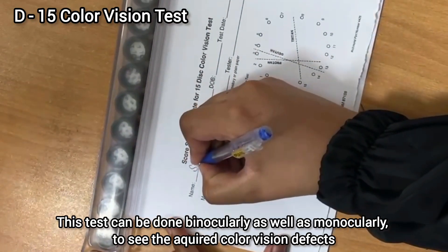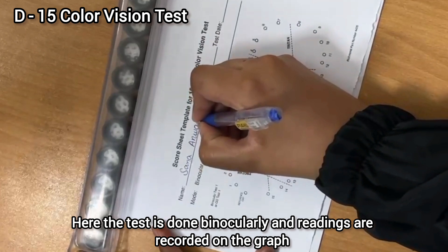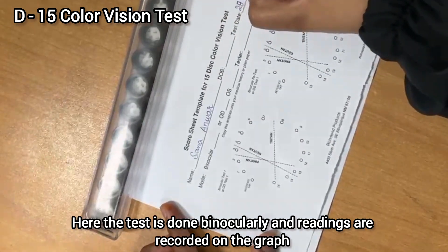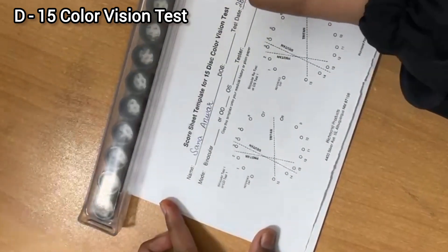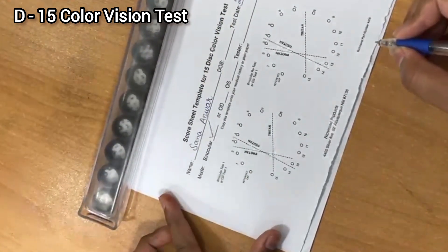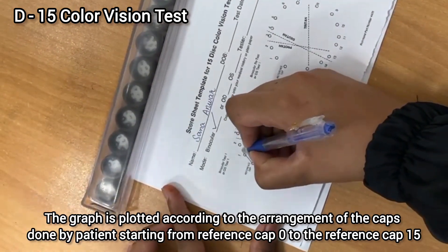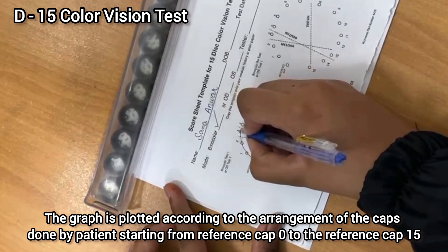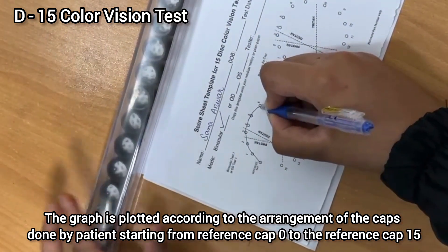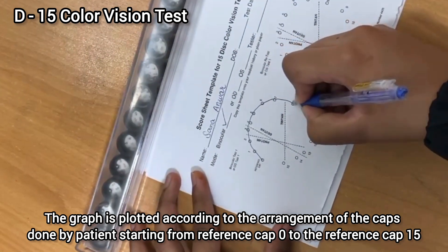In this video, the patient has arranged very accurately — all the caps are in sequence and we are going to plot the graph. This test can be performed binocularly or monocularly. Here we have performed the test binocularly. The graph is plotted simply by joining the points that correspond to the caps the patient has arranged.